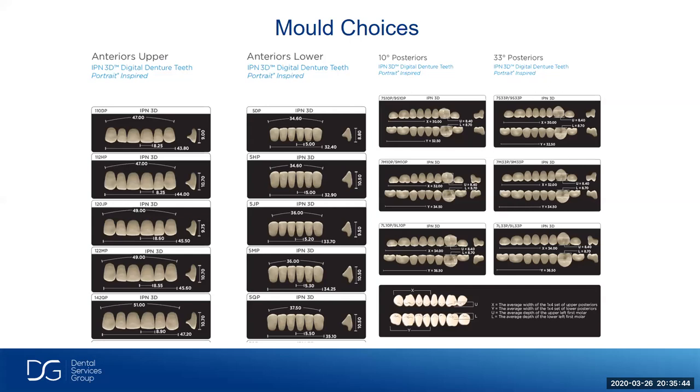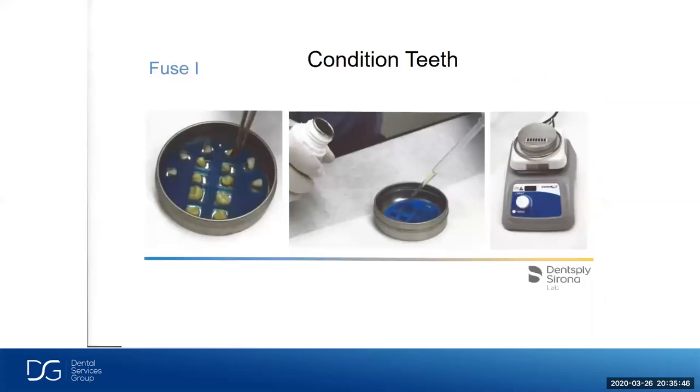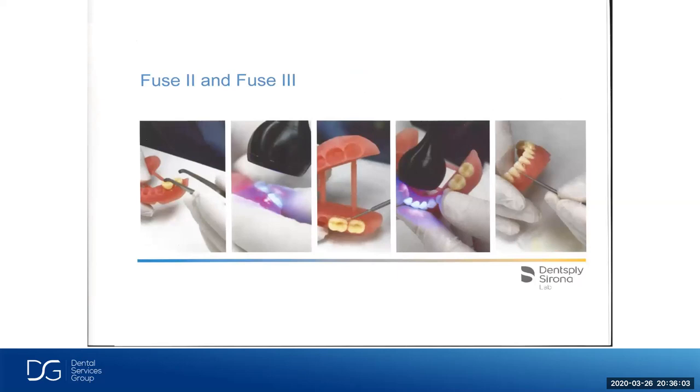So at this point, we're ready to fuse these denture teeth into the denture base. And the first thing we're going to do is condition the teeth. We use a material called Fuse One, and it actually gets the teeth ready to bond and fuse to that denture base. We're conditioning these teeth on a warming tray, and then we're going to insert them into the actual sockets that were printed for us in the denture base, and it's an exact fit.